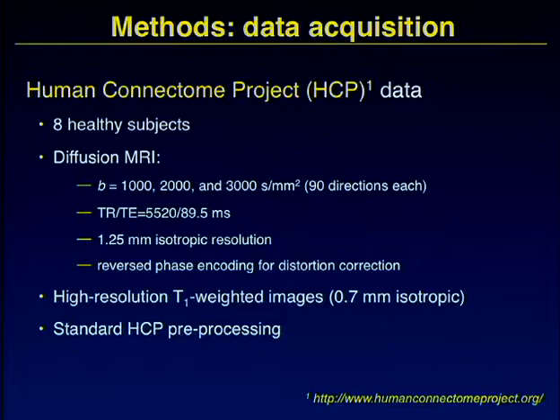And in particular, it lets you acquire, for those interested in diffusion, images that are faster, with better signal-to-noise ratio, and much finer detail. The pixels are much smaller. But this type of scanner, you won't see appearing in the next few years in the hospital because, for example, to run this scanner, they need the same power that you need to run a nuclear submarine. So really, it's a ridiculous amount of power they need to run these things.